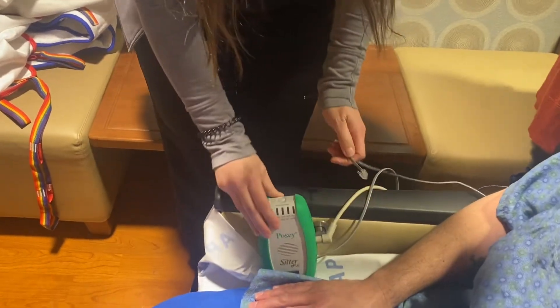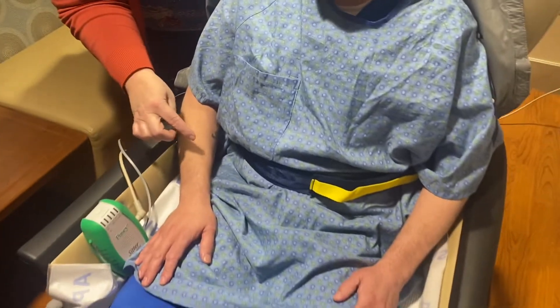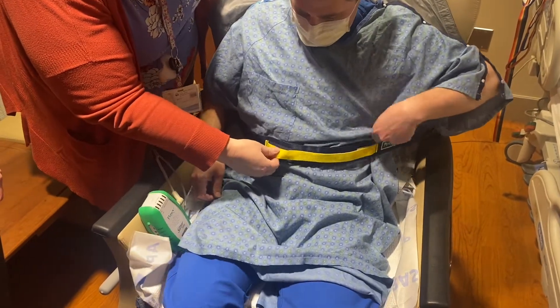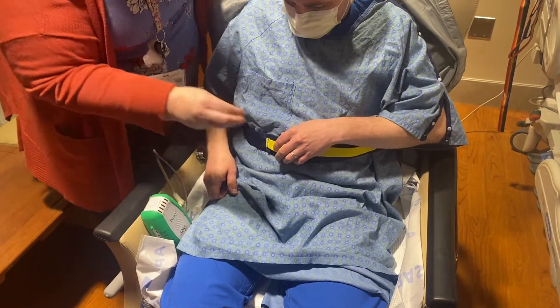we do need to make sure that our patient is able to use the strap appropriately. Mr. Ears, you see this yellow strap here? I see it. So this is Velcro — do you know what Velcro is? Yeah, like my shoes.